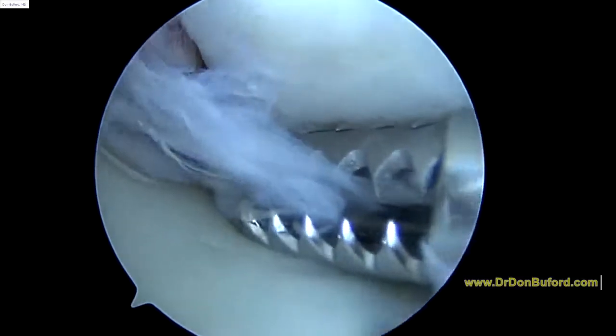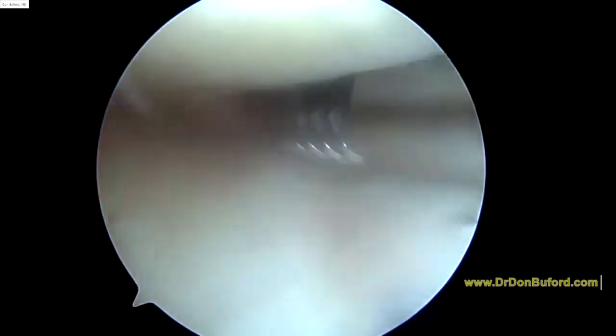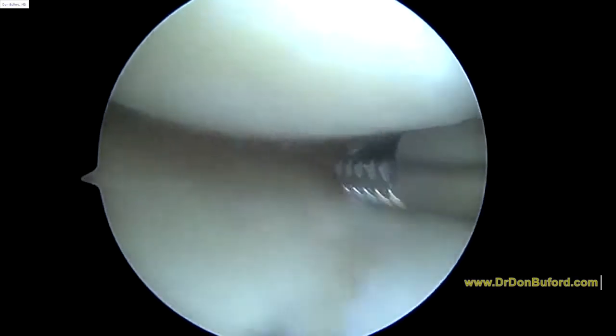Hey Damon, it's Dr. Buford. Just getting started on the right knee. There's some torn tissue here — we're just going to remove that. And then we're going to look in this medial compartment. I'm just turning on the suction to flush the knee out pretty well here.